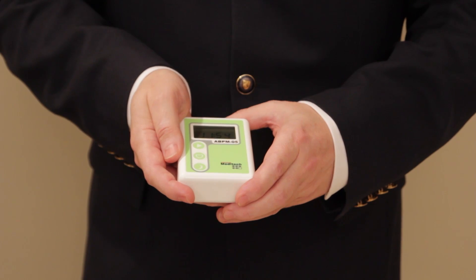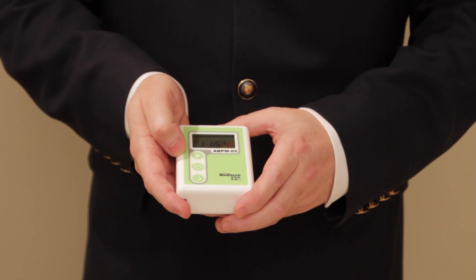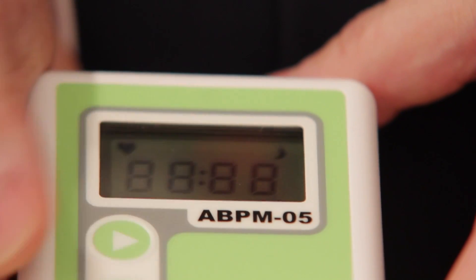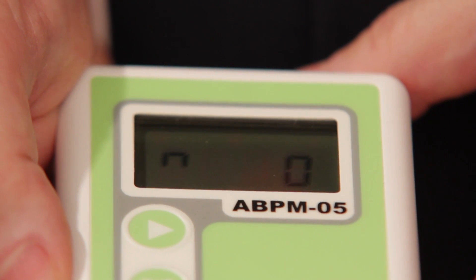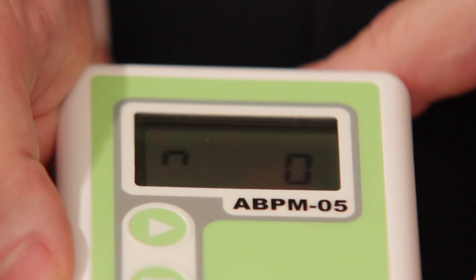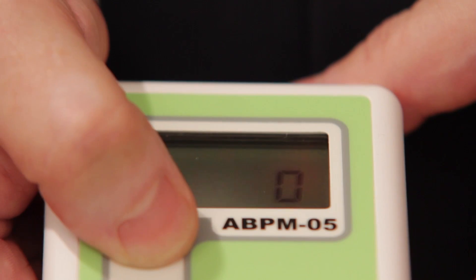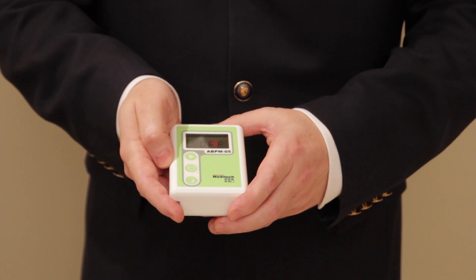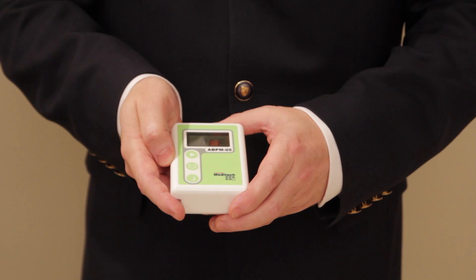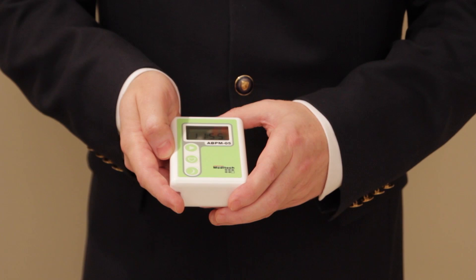Once the batteries are inserted, the time will be displayed on the LCD. If you press the start button to initiate an extra measurement, the device will show all segments on the LCD, then set to zero pressure level and start pumping. If for whatever reason you would not like to finish an ongoing measurement, press the same button again to cancel it. 'Off' is displayed on the LCD with multiple bleeps. This will not influence any following measurements in the plan — they will execute correctly.